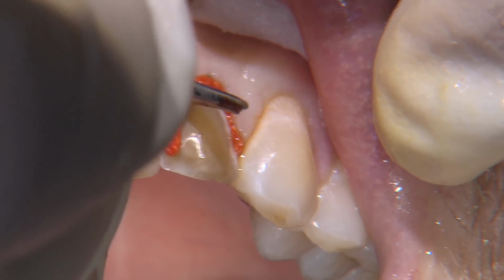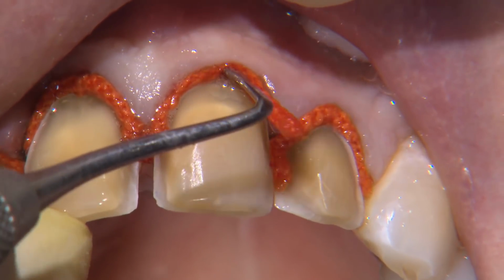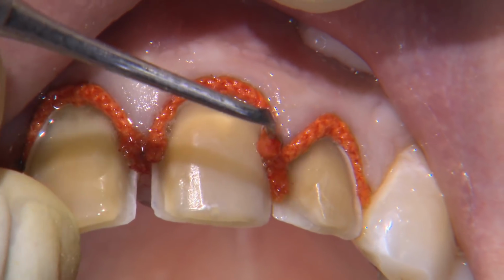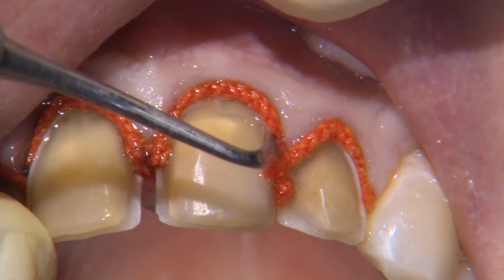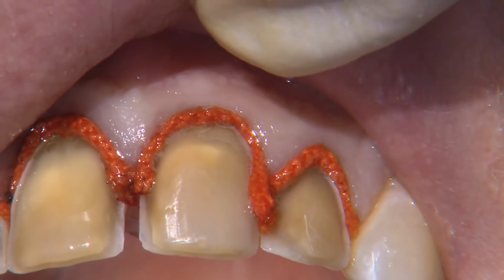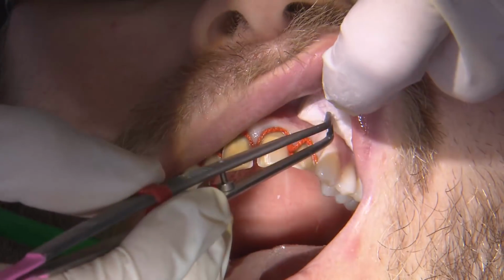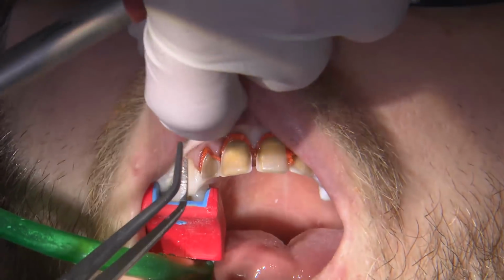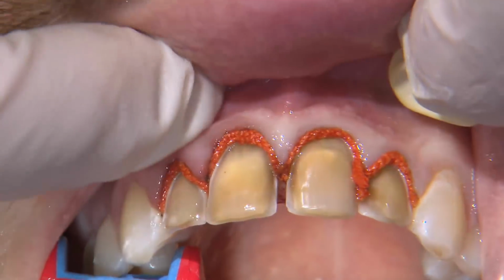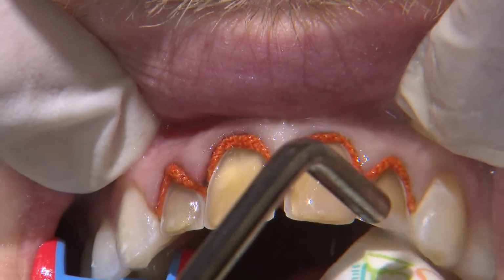When the preps are completed, I place a second layer of cord into the sulcus to push the tissue laterally away from the teeth. Here I'm using a size 2 and using gentle pressure to push the cord into the sulcus and then rotating the instrument out to lock it in place. If you're having trouble getting the cord to seat, go down a size until you find one that can seat adequately within the sulcus. The cord should be seated into the sulcus without much force, as we want to avoid any potential damage to the attachment.